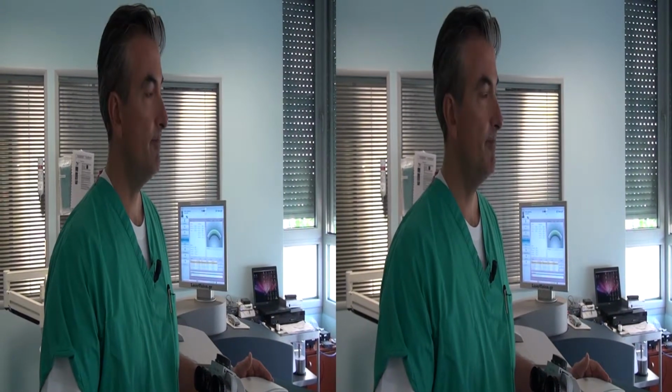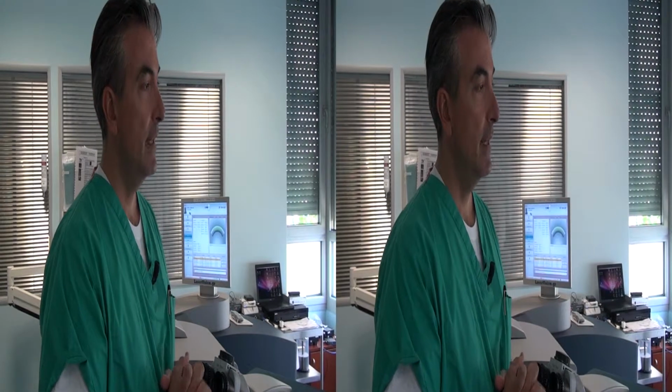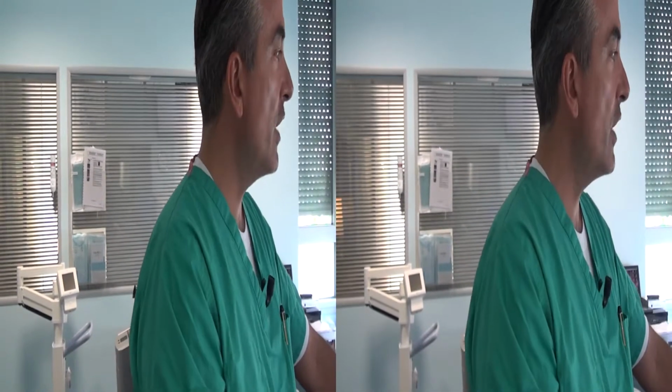We have introduced the combination of a partial topography guided normalization of irregular corneas that we find in keratoconus and post laser ectasia with high fluence collagen cross-linking. And you can see here an example of a 26-year-old lady. We'll turn onto the screen.